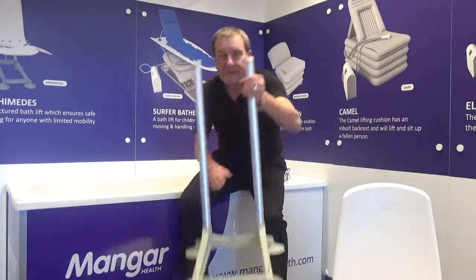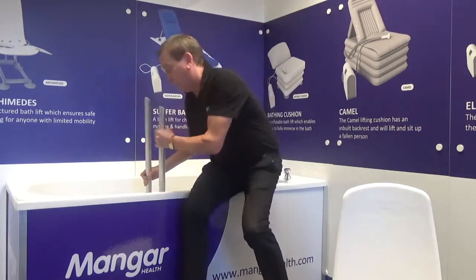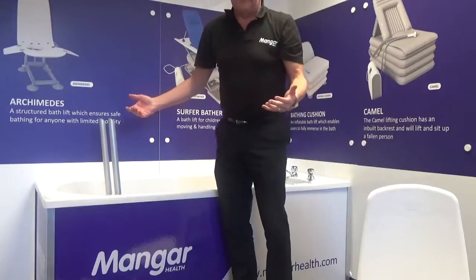The first one is the base. 4 suckers on the bottom of the base, and what we want to do is position this as far back as we possibly can. Once that's into the bath, I just push down on the frame and it's locked in place.